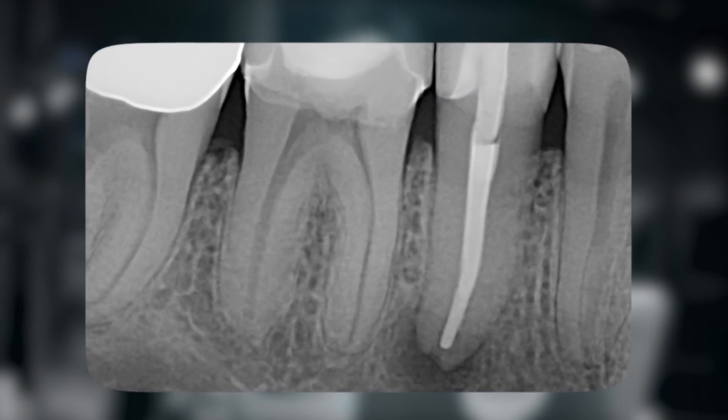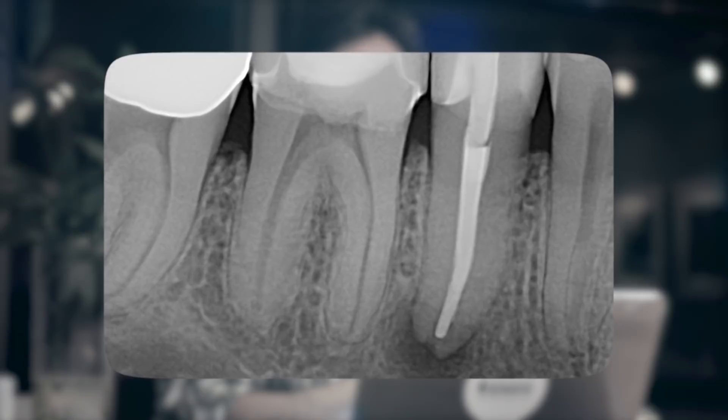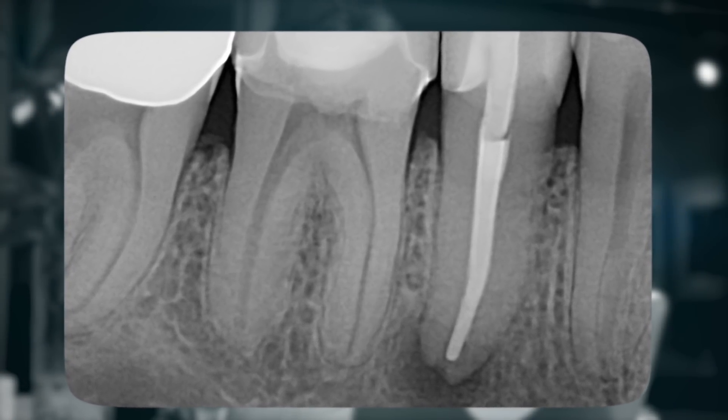Today's case is a mandibular second premolar that had root canal therapy and a crown several years ago. The patient was unaware of when the treatment was done except that it was a few years ago, but there was a well-sealing crown present that appeared adequately filled, but a large periapical lesion was present.